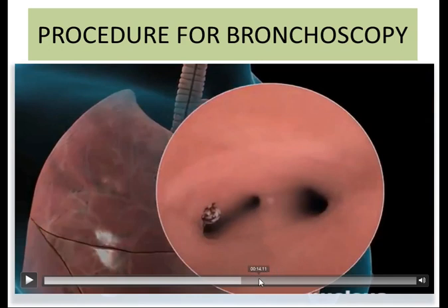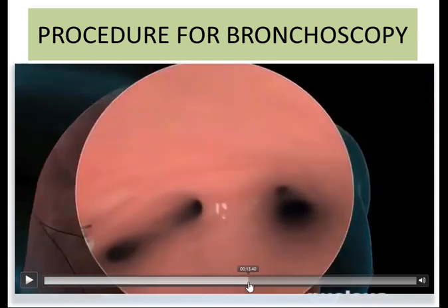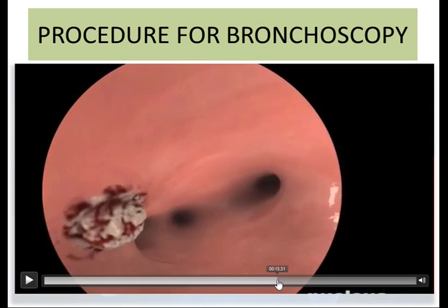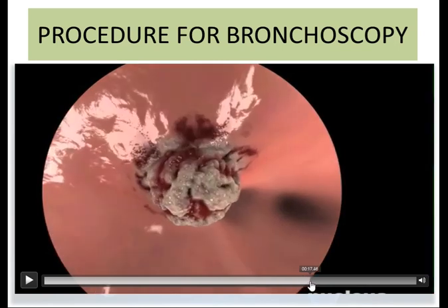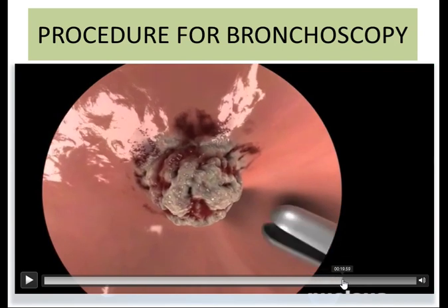Moving farther past down, on the wall of the bronchi we find a swelling — some abnormal appearances consisting of blood vessels. We need to collect a part of this abnormal growth, and for that bronchoscopes can be very helpful. Moving farther, we are finding out this particular abnormal outgrowth through which we will introduce another accessory of the bronchoscope. We are now very close to this abnormal growth and we have introduced this forcep. This is the forcep which will be applied over the abnormal growth to collect a tissue.